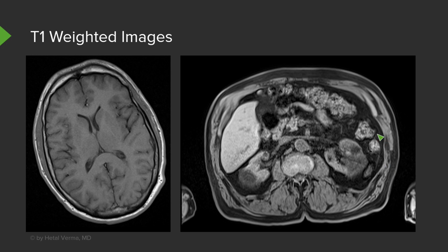This is an image through the abdomen, and you can see that the liver is a little bit bright on the T1 weighted images, but this area right here, which actually represents a cyst within the kidney, is dark because this is a T1 weighted image.